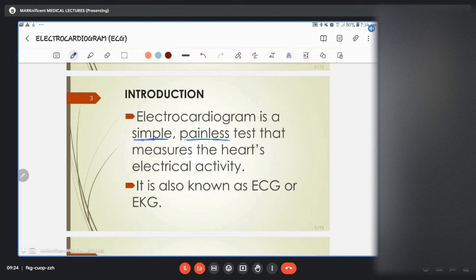However, in some developed countries with modern medical means, you can have these ECGs on the monitor. You don't need to print out the graph and start reading it out. Everything will be there on the monitor, which means you can send it as an email to the cardiologist.